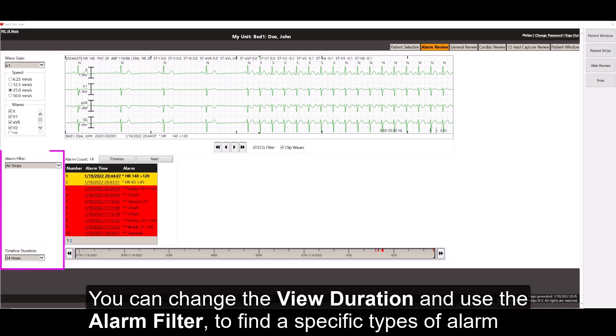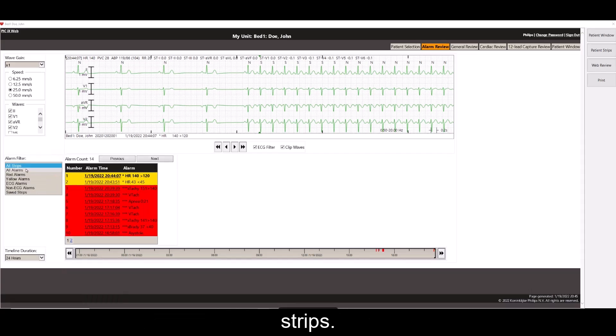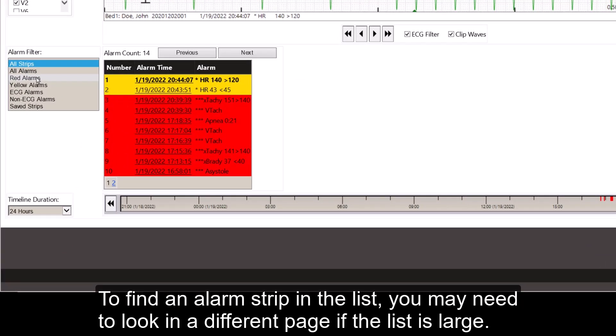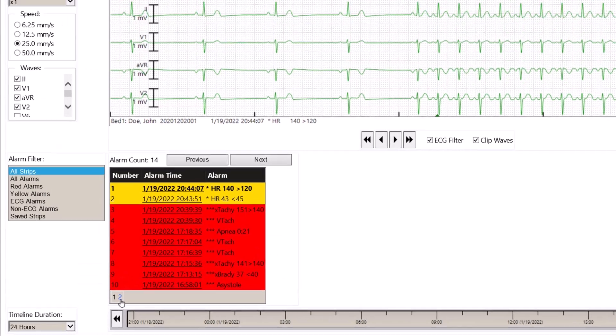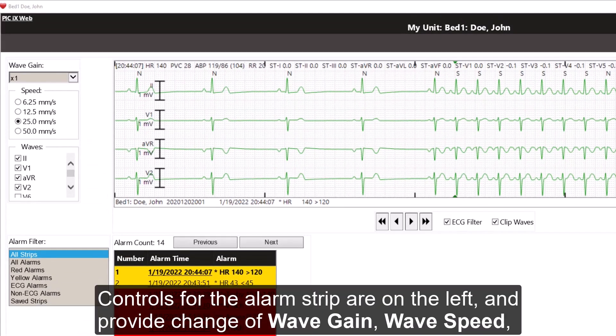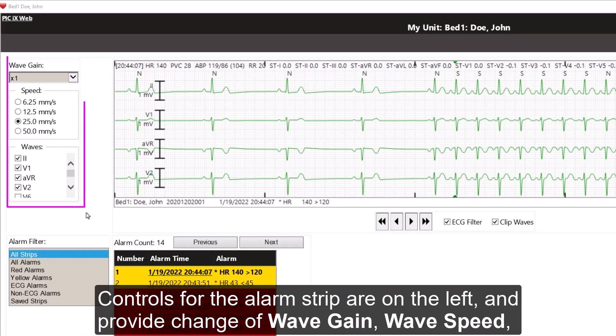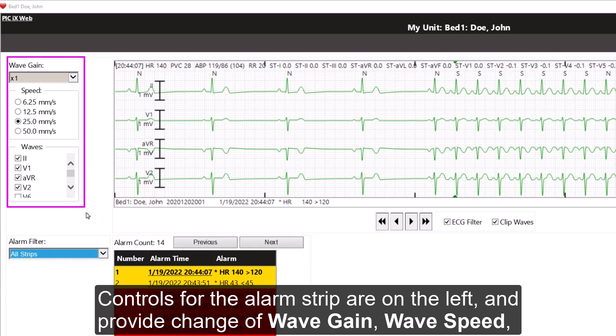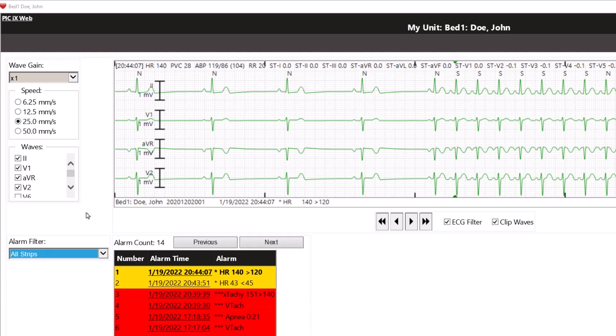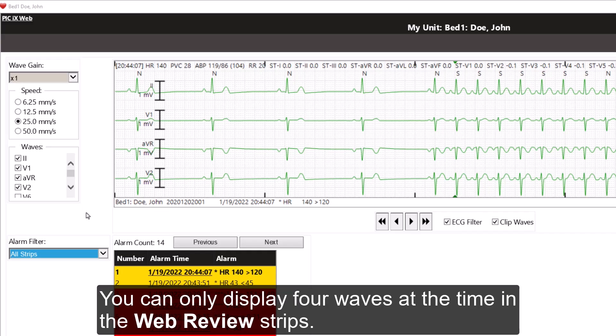You can change the view duration and use the alarm filter to find specific types of alarm strips. To find an alarm strip in the list, you may need to look in a different page if the list is large. Controls for the alarm strips are on the left and provide a change of wave gain, wave speed, and choice of waves display. You can only display 4 waves at a time in the Web Review strips.